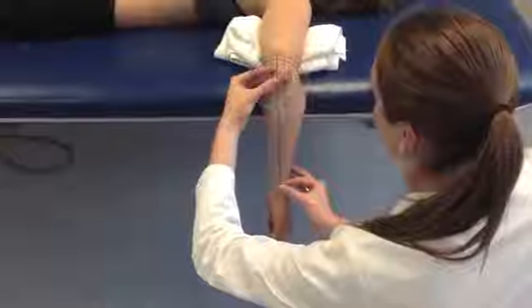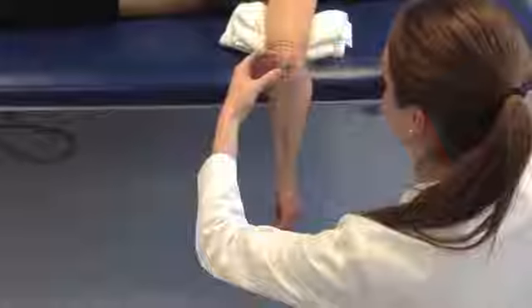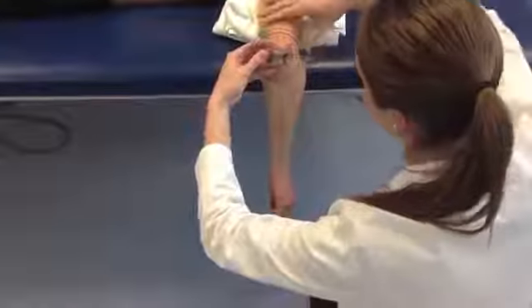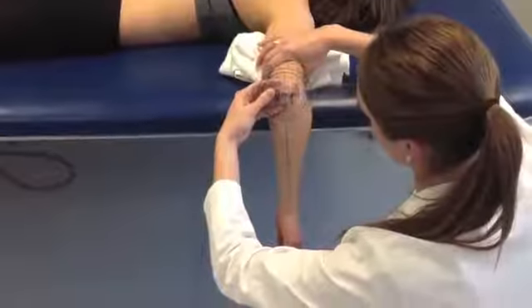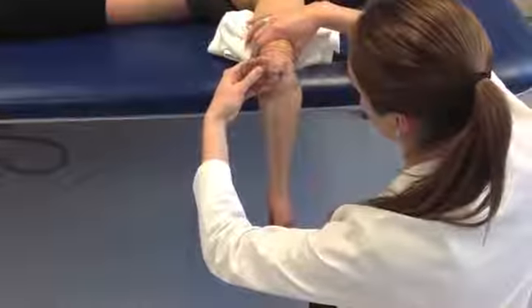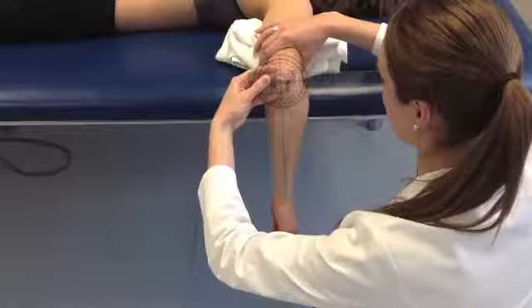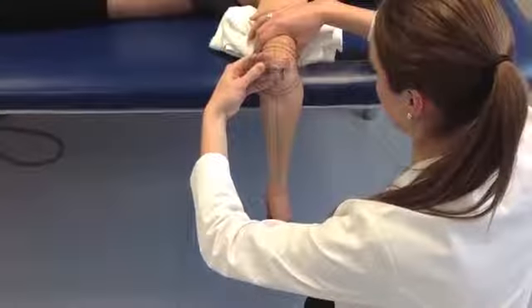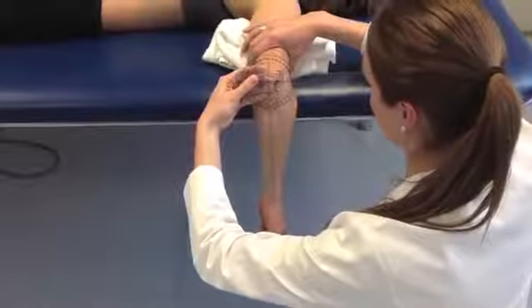After observing the patient's range of motion, the therapist can estimate the measurement by placing the movable arm at the expected range while making adjustments as the patient reaches end range. While conducting the exam, the therapist should be stabilizing at the distal humerus to prevent the patient from compensating by lifting the arm or shoulder off the table. If specifically measuring glenohumeral external rotation, stabilize at the scapula. The therapist should also be aware of other possible compensations, such as excess lumbar extension and posterior tilting of the shoulder once the patient has passed end range.